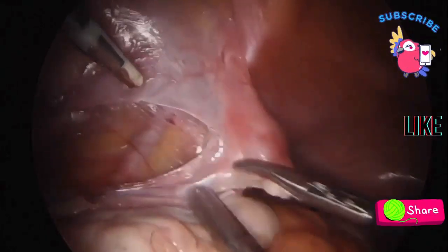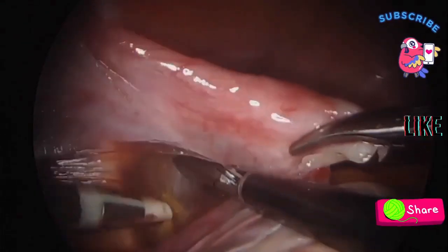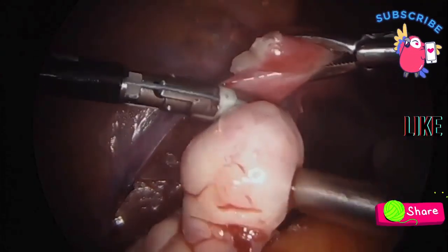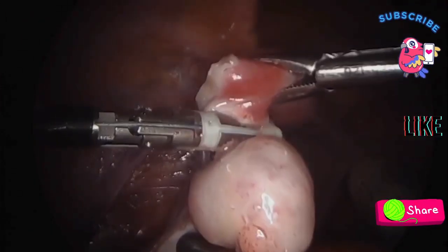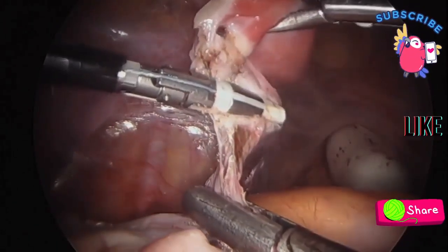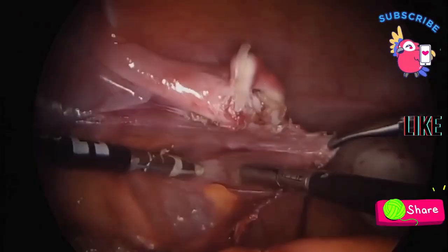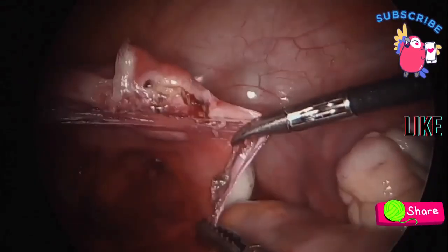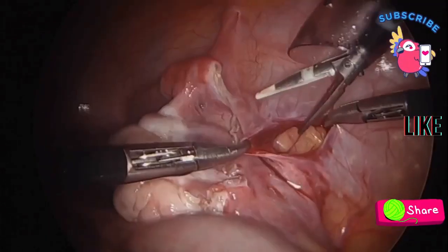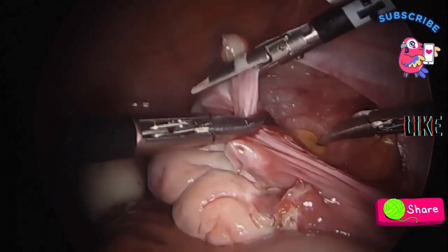Step 4. Dissect the pelvic sidewall. The retroperitoneal space is opened, and the pelvic sidewall structures are lateralized off of the peritoneum. This helps avoid tension on the pelvic sidewall during the formation of the neovaginal apex and maximizes the peritoneum available to create the upper vaginal vault. The uteroovarian ligament is divided to preserve the anatomical location of the ovaries. This avoids them from being pulled medially when suturing the apex of the neovagina, unlike in the traditional laparoscopic approach. The same is then performed on the right side.